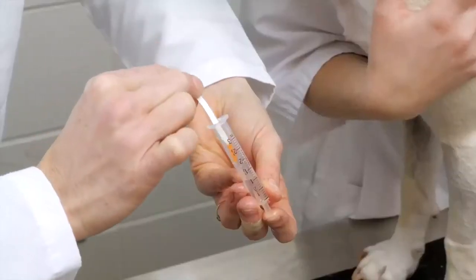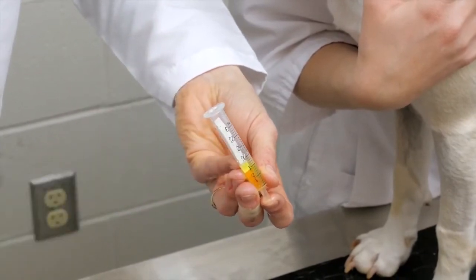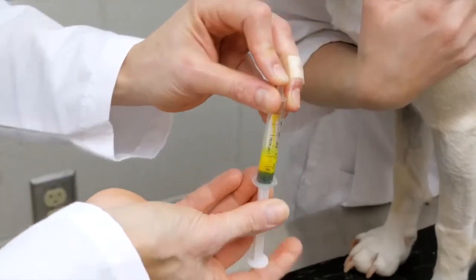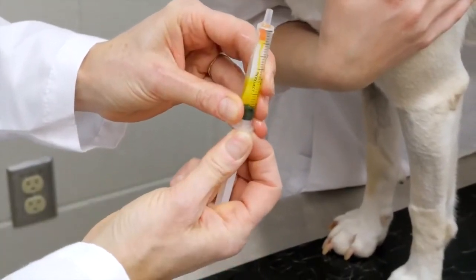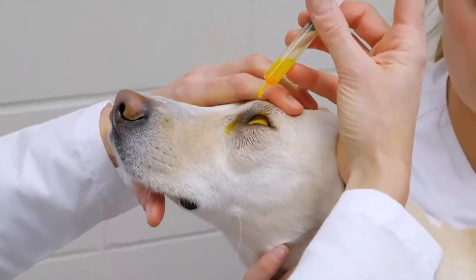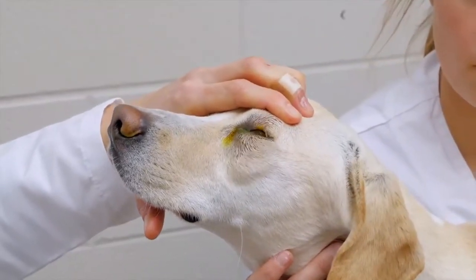Some clinicians will place a fluorescein strip in a 3 milliliter syringe with a small volume, 0.5 to 1 mL, of sterile saline wash, and then drop the fluorescein solution directly onto the cornea. This is an acceptable method for fluorescein staining, assuming that the dye is not diluted in a larger amount of fluid, as fluorescein dye that is too dilute can result in a false negative test.